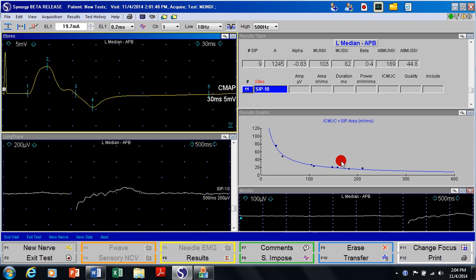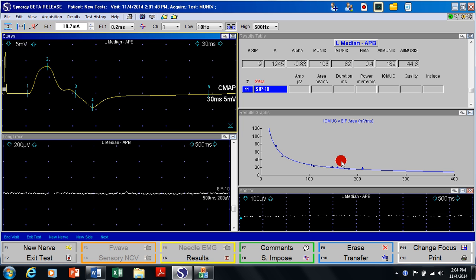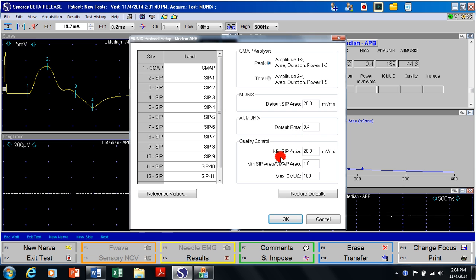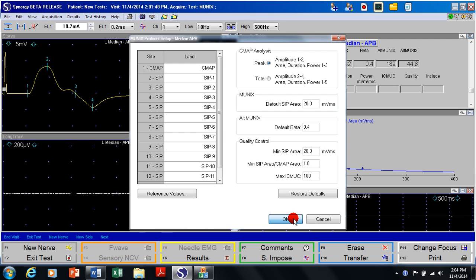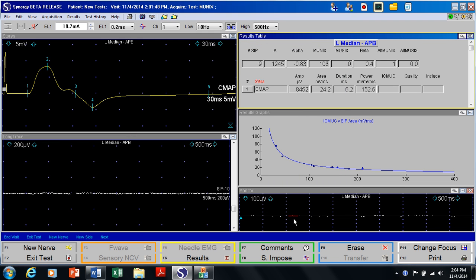So this is the way we can do the MUNIX study. Usually we record 10 SIP signals but in this program we have the ability to record 29 SIP signals. We have built in the criteria for acceptance, shown over here — the minimum SIP area should be more than 20 and so forth. These are the parameters that could be changed, mainly for future research. We have also something called alternate MUNIX formulation that we are exploring. All of that computation is built into our program right now. MUNIX is fully integrated into the EDX software and as you can see it is quite easy to do and it takes only a few minutes to perform. Hope it helps.